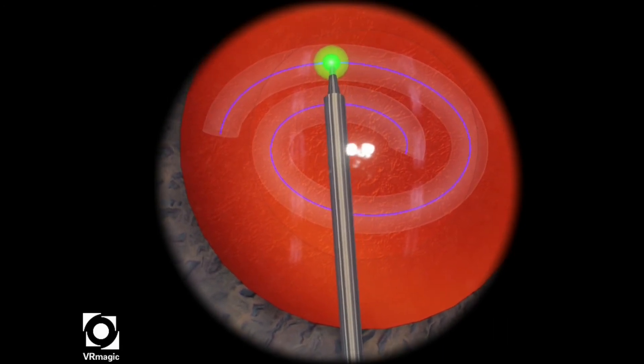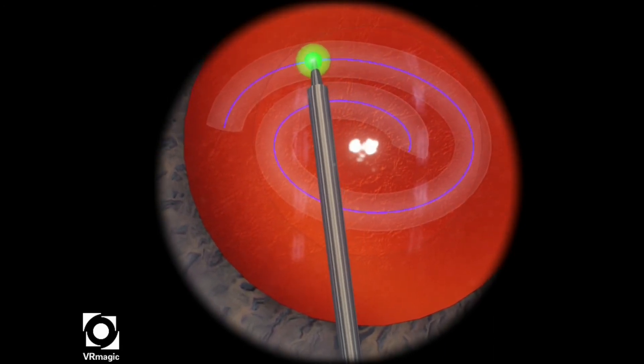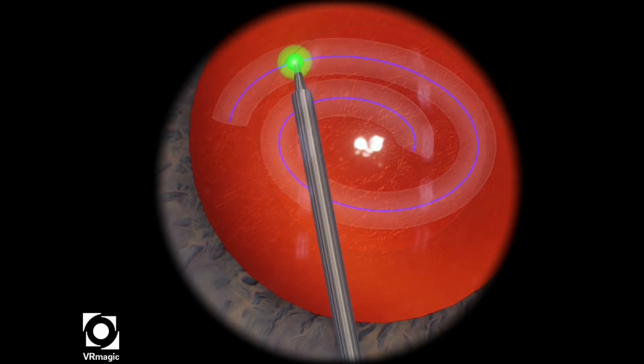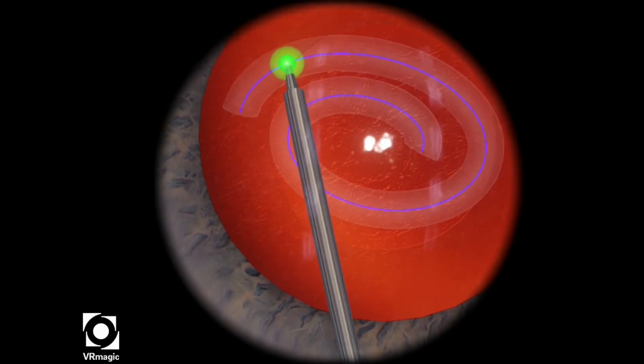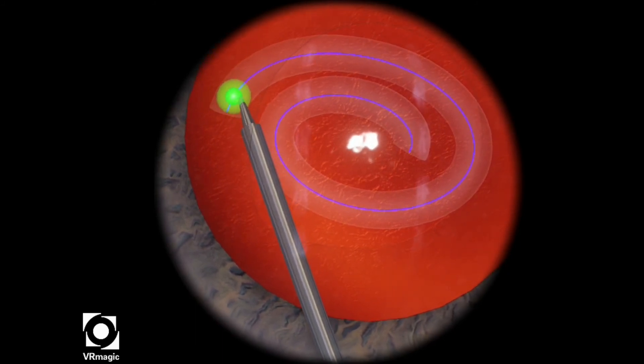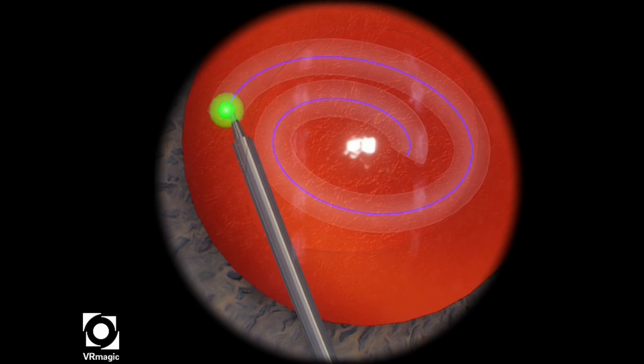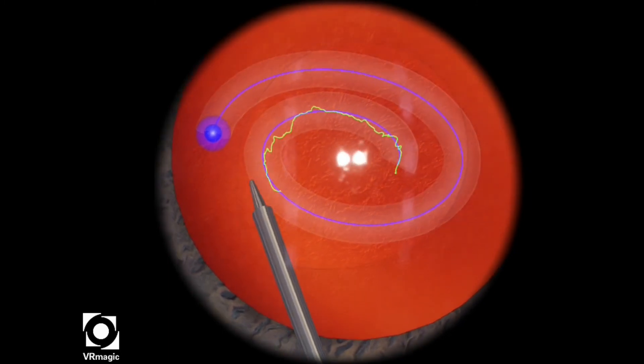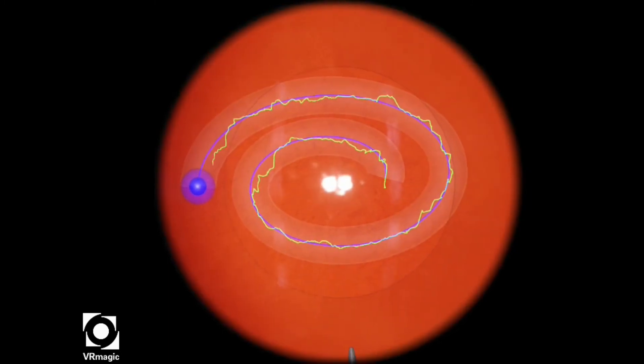One amazing tip that I found was to not grip your instrument too tightly, but rather if you get loose and let the weight and the torsion do their job, it's much easier to navigate your instrument very smoothly.